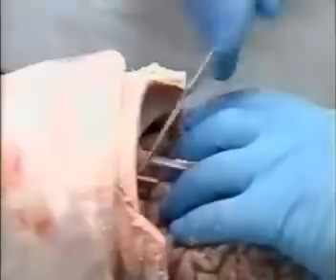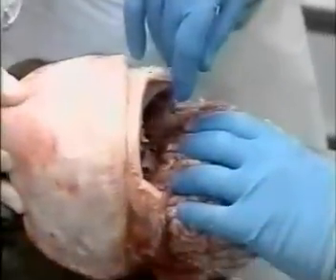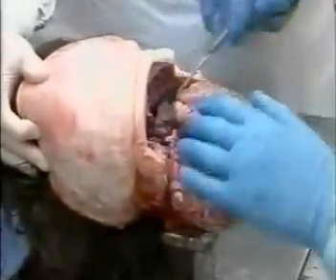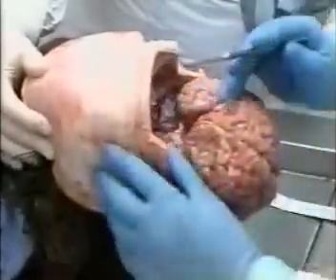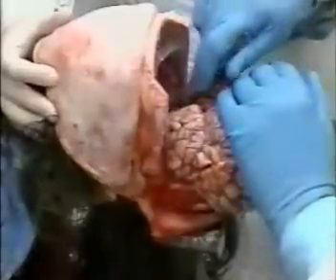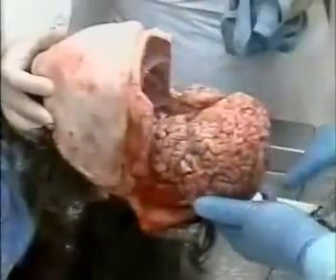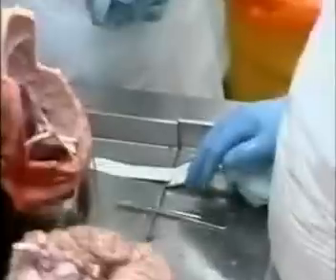The first thing he'll do is reach down and cut the optic nerves — they're the first thing holding the brain in place. Once those have been cut, he'll cut some of the other cranial nerves, and then he'll need to make an incision through the tentorium, which is a tough membrane that holds the cerebellum in the posterior fossa of the skull. Once that's done, he can put his knife down into the foramen magnum and transect the spinal column to essentially deliver the brain.